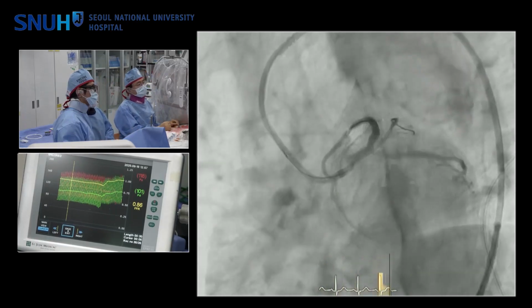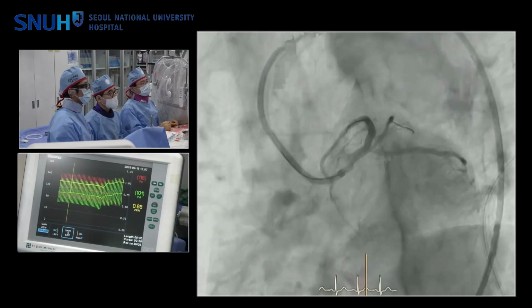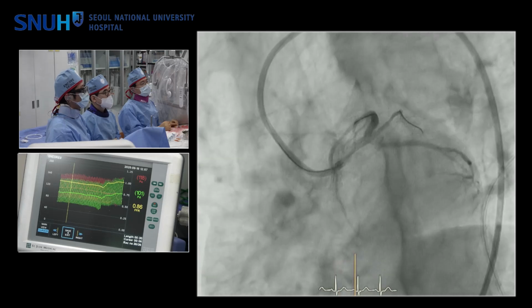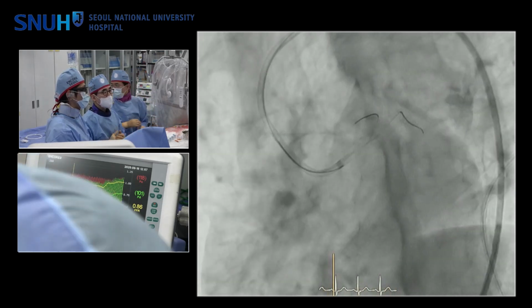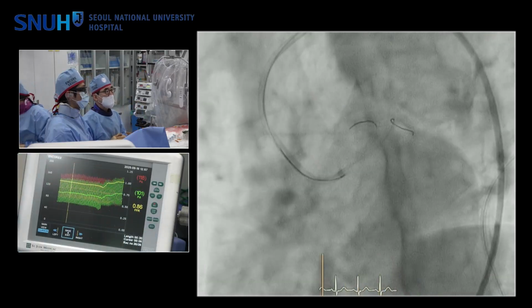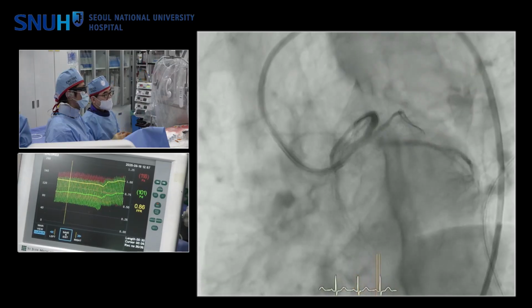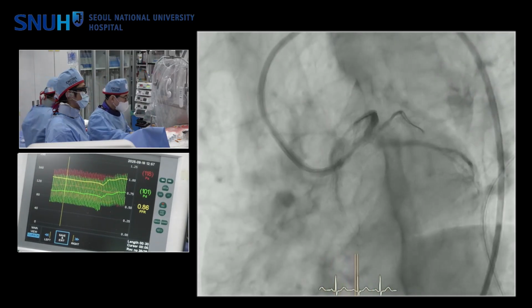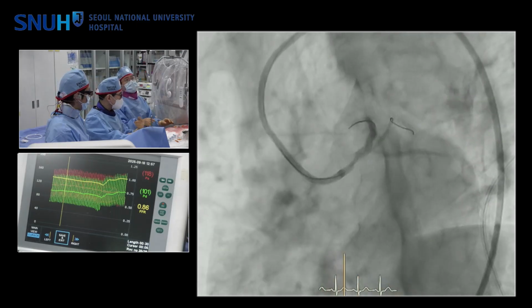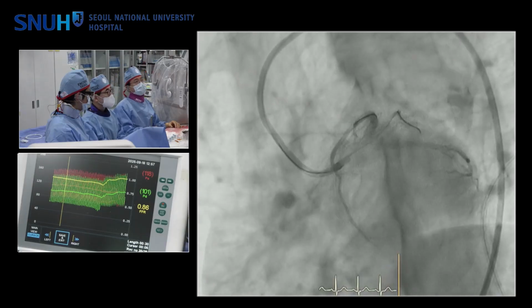Okay, we are going to calculate two VFR, in the anterior and caudal view. Invasive FFR told us that there is no significant perfusion disturbance to the circumflex. I think Ramus intermedius is good. Because I'm going to Ramus intermedius, average. So we got another value using VFR.